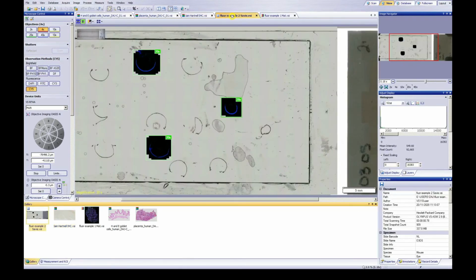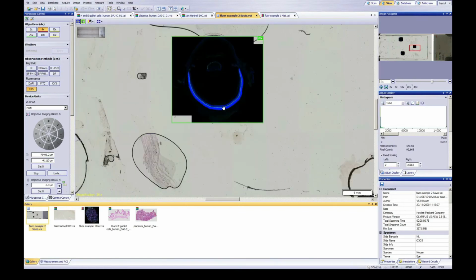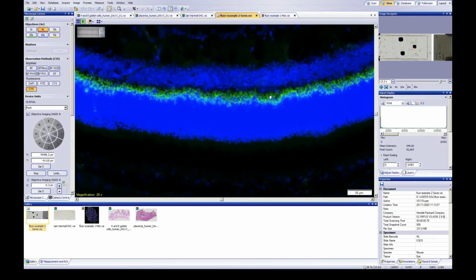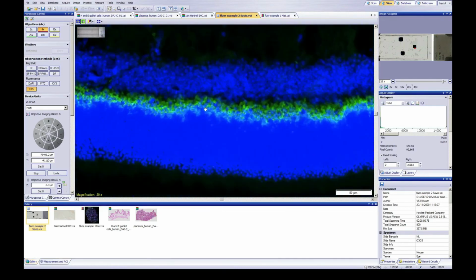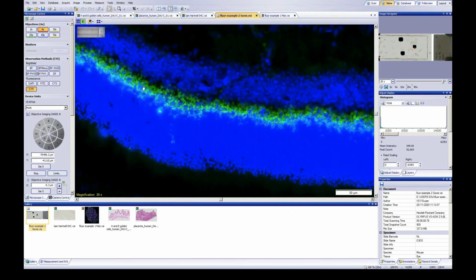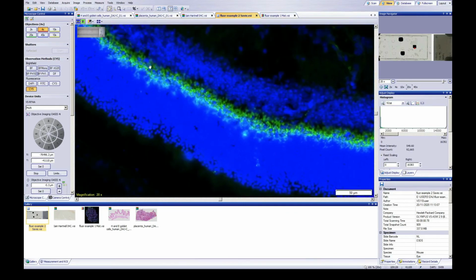And this is a fluorescently labelled sample. These are sections of a mouse eye, which again have been stained with an antibody, but this time fluorescently labelled, and it highlights a single layer within the retina. The nuclei of the retinal cells have also been stained here with a DNA binding stain, which stains in blue, and our antibody is staining in green. There are 909 individual images in this dataset.